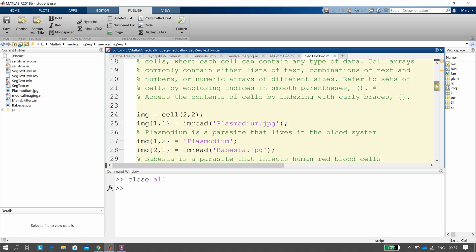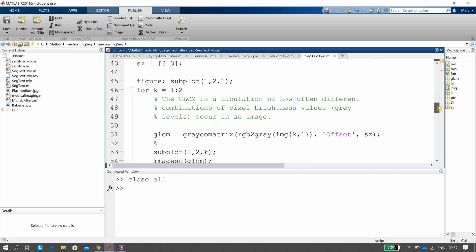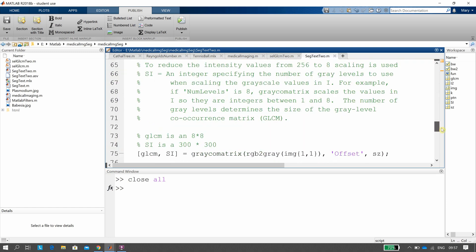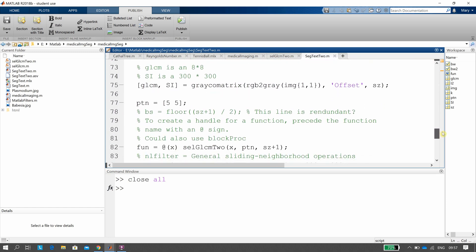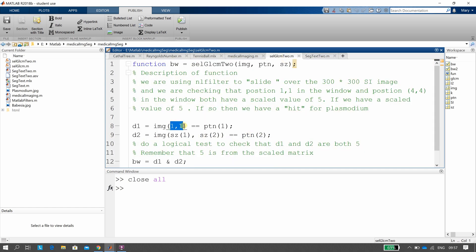SZ is 3 from up above, but at this point in the code it's called as SZ plus 1, so that makes 3,3 become 4,4. So when we look at the code, you're looking at position 1,1 being 5, and position 4,4 also being 5.